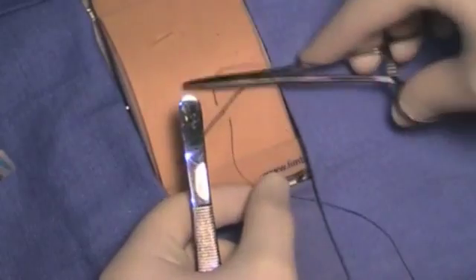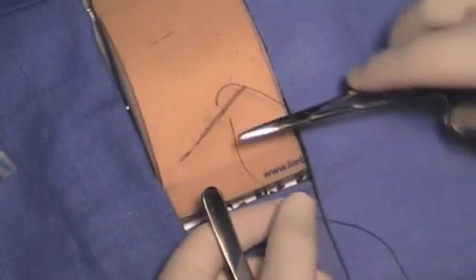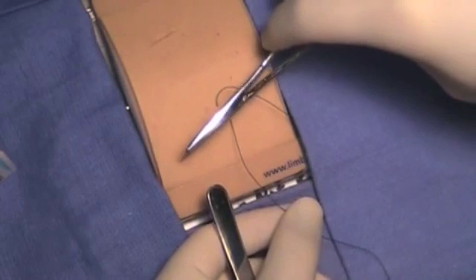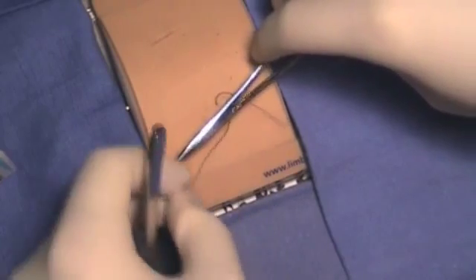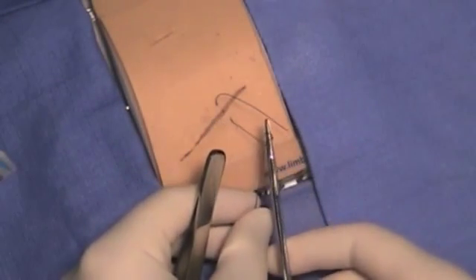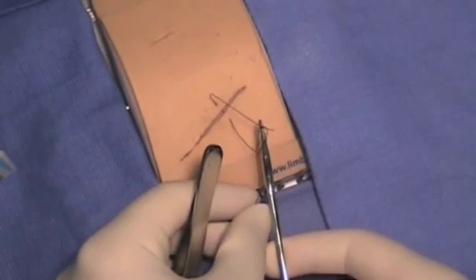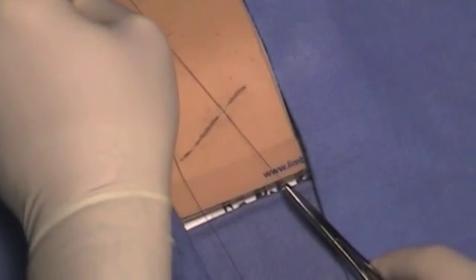Now we will perform an instrument tie. The needle driver should be on the inside of the suture material. You can do it by aligning the needle driver above the wound and pulling two loops around your instrument. Grab the tip of the short end one centimeter away from the tip and pull towards yourself, or towards the long end.